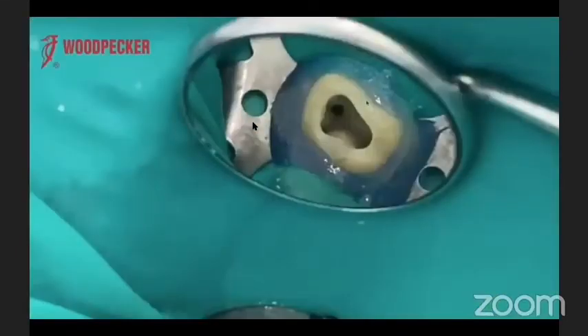In this upper molar, the MB2 canal was located in the same orifice as the MB1 canal. I had to widen the MB1 canal orifice to shape the MB2. If I tried to do it with stones or burs using a handpiece, I would only end up doing perforation, because this area has very thin tooth structure. So I had to be conservative and use selective cutting efficiency.